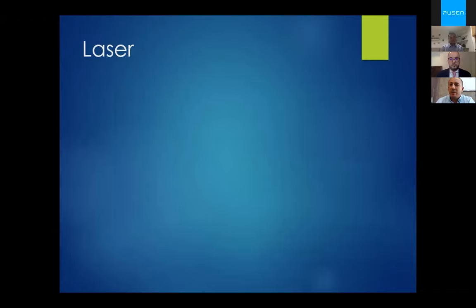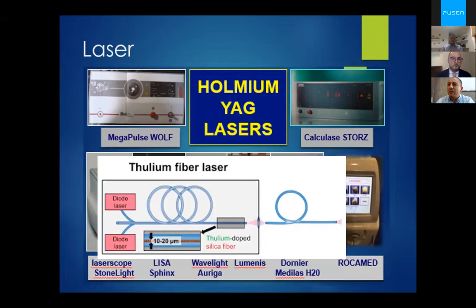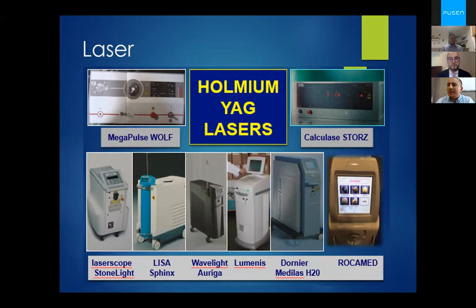Here we pass to the laser. The most used laser for flexible ureteroscopy is the holmium laser source. More and more we are talking about thulium fiber laser as an alternative source. We will talk about holmium, the classic. The main mode of action is the transformation of light energy into thermal energy, a photothermal effect, with vaporization effect. This energy is absorbed by water, is very precise, and has reduced tissue penetration.